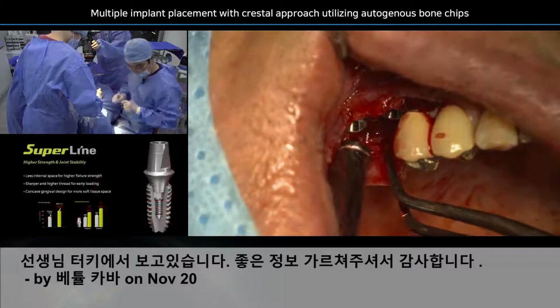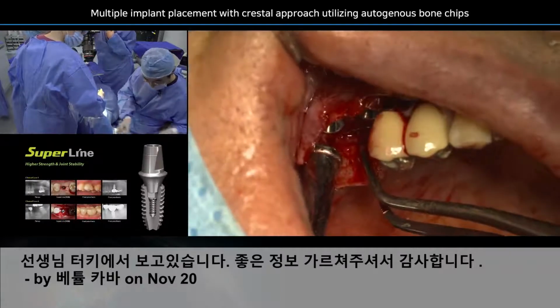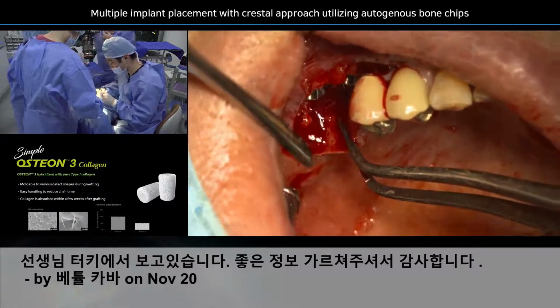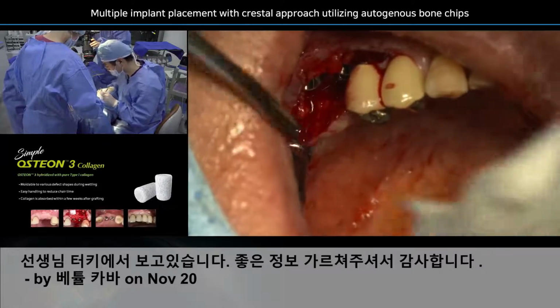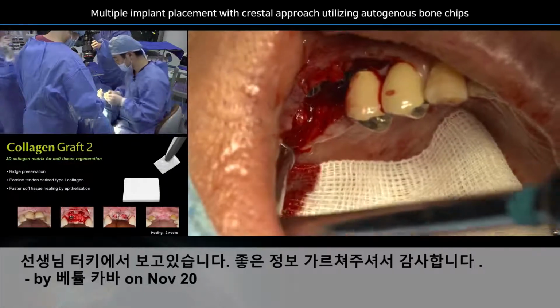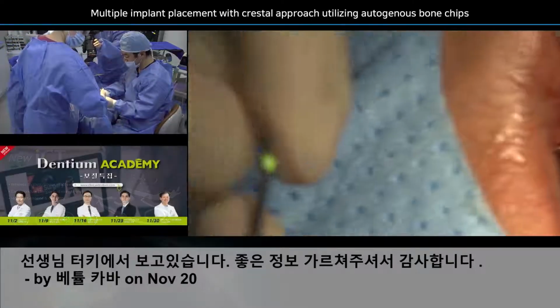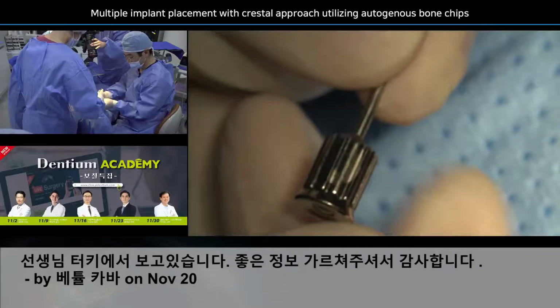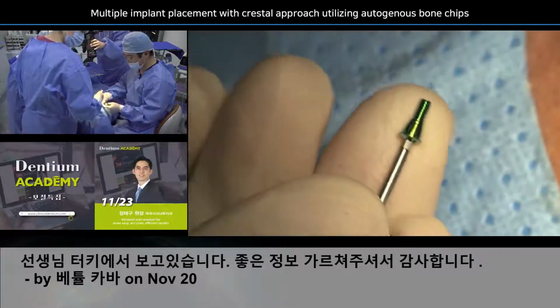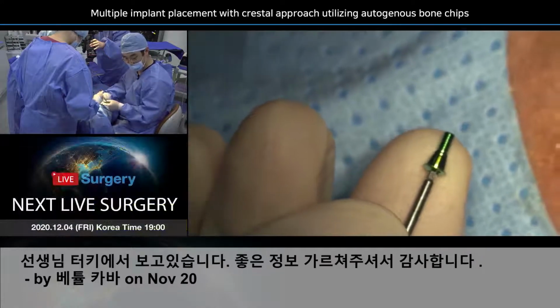So now we're going to connect the cover screw first. When you are dealing with a small instrument, sometimes you may be afraid. So this is my recommendation. Put the gauze into the mouth cavity. In case you drop it, it's not going to properly protect it, but it's going to help you a little bit better. And this is the way you hold the cover screw. Connect it, hold it with the thumb and index finger, and my middle finger always supports it. It doesn't drop. So this is a very nice way to deliver small instruments inside the mouth cavity.